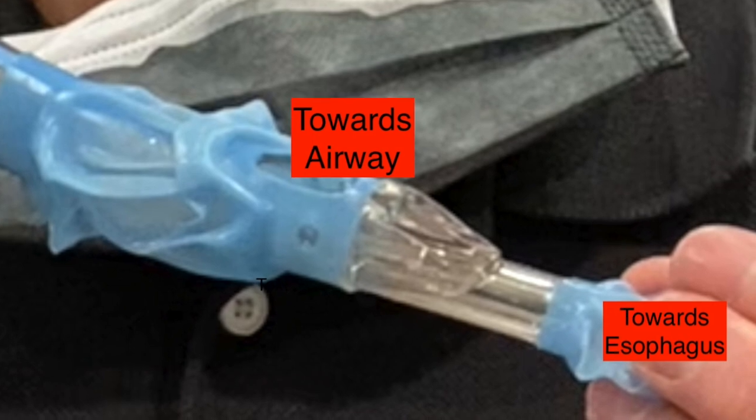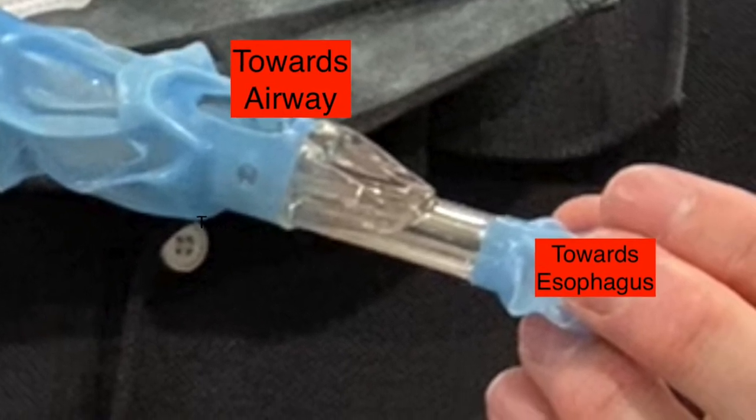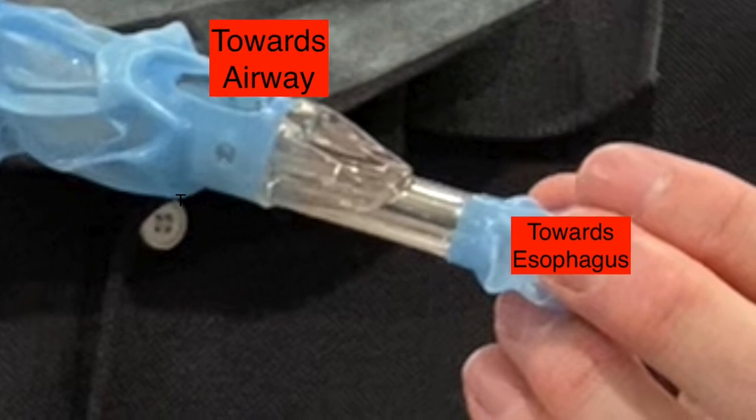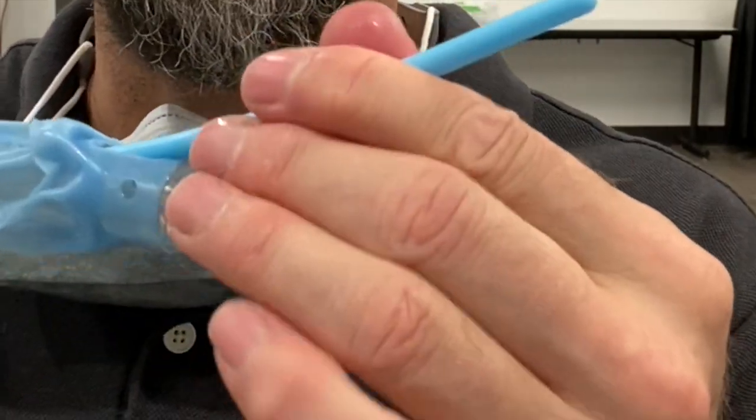Critically, you cannot pass the fiberscope through the end of the King, which is obstructed by plastic and leads to the esophagus. You must turn to exit through the side port. Pass the fiberscope between the cords and several centimeters into the trachea.